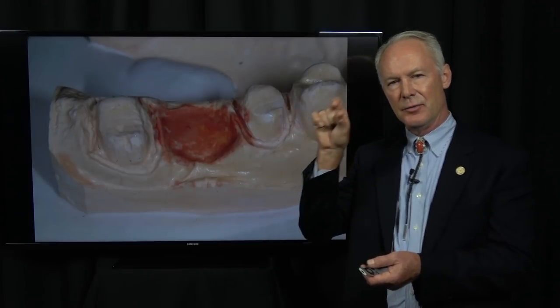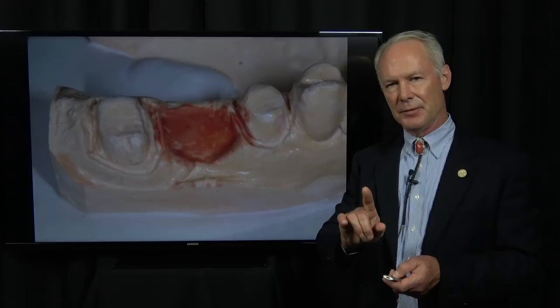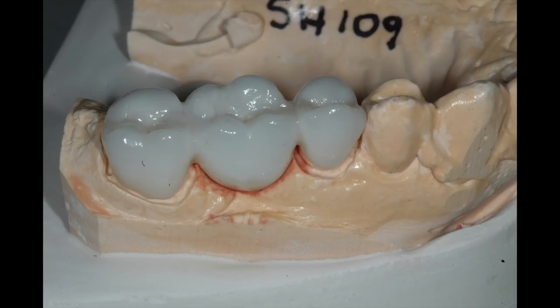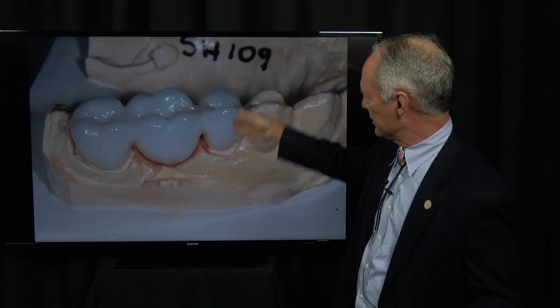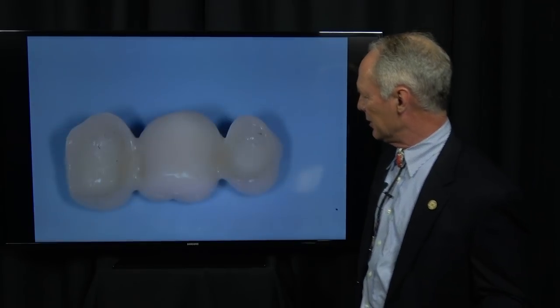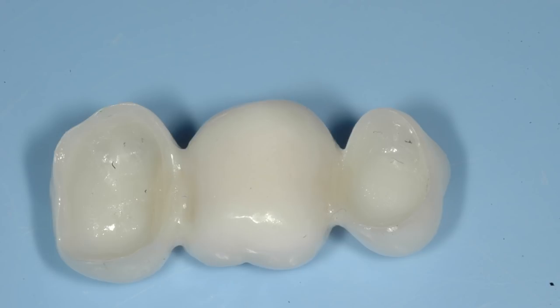The patient will love you because they're not going to pack food in that area. When you place your bridge, you want the gingival tissue to blanch. Willie Geller, the great technician in Zurich, Switzerland, that I worked with for many years, taught me this technique. It's fantastic. The gingival pontic receptor side and the interproximal contact should be perfect — you should never have to adjust those. I want that to be an ovate pontic.